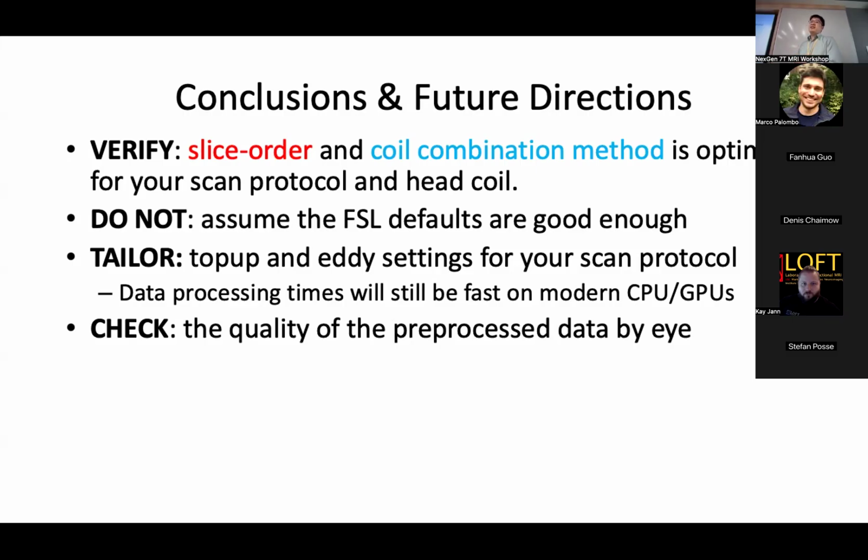It's kind of obvious, and this is a good one for maybe the Q&A, but Peter Basser's group has used some of the best scanners in the world, our scanner, the Connectome 2, at really high resolutions. At the end of the day, they said the images look so crisp, but after they go through the processing pipeline, they look like mud.